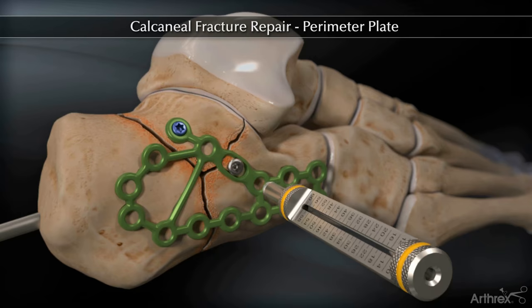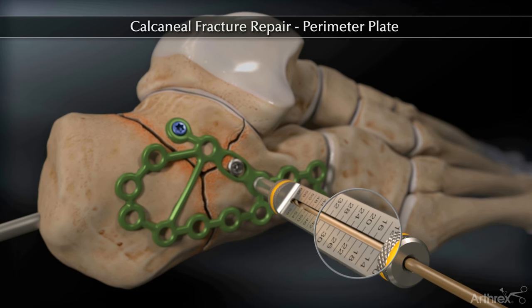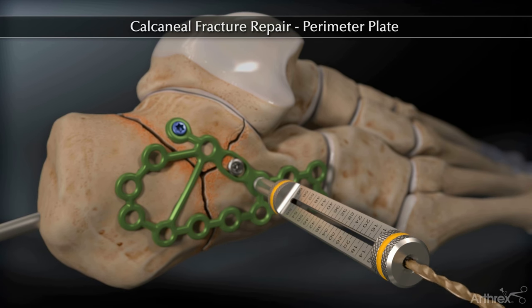Insert the 3.5 mm locking drill guide. Drill and measure off the laser line on the drill, then insert the appropriate locking or non-locking 3.5 mm screw.